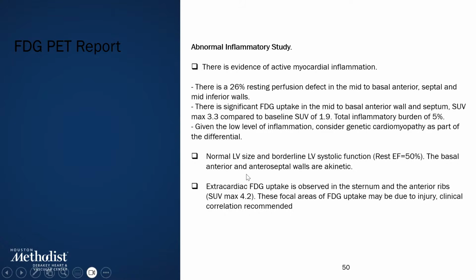The patient wasn't started on any steroids after the MRI? He was started on steroids. That might also explain why the patient was bumped up. Very true. Yes, it might. His LV function was 50%, and I think it's of interest to me that the EF correlated across all modalities and was approximately 50%.